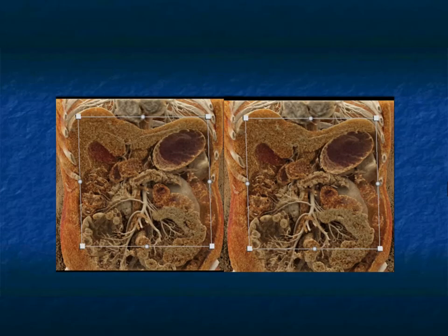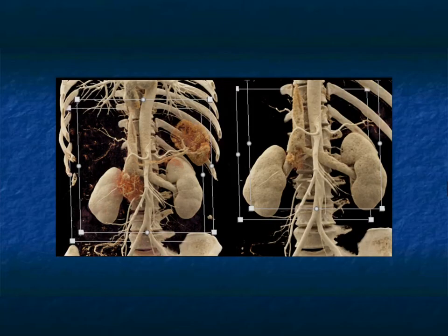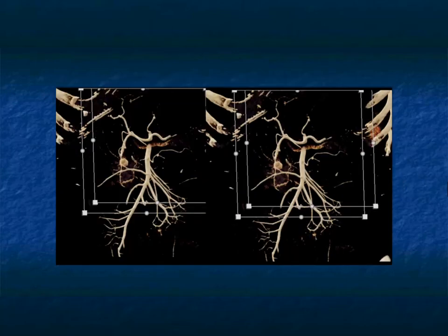When you look at the cinematic rendering, you see the dilated pancreatic duct. As I change the texture maps, you see the GDA. You also see the patient's tumor right there and there. And as I go into the data set, take away a lot of the other information, showing you now the celiac with GDA, hepatic artery, the SMA with its branches, and showing you the tumor standing out. One of the key things we're trying to do is create images where the pathology stands out.